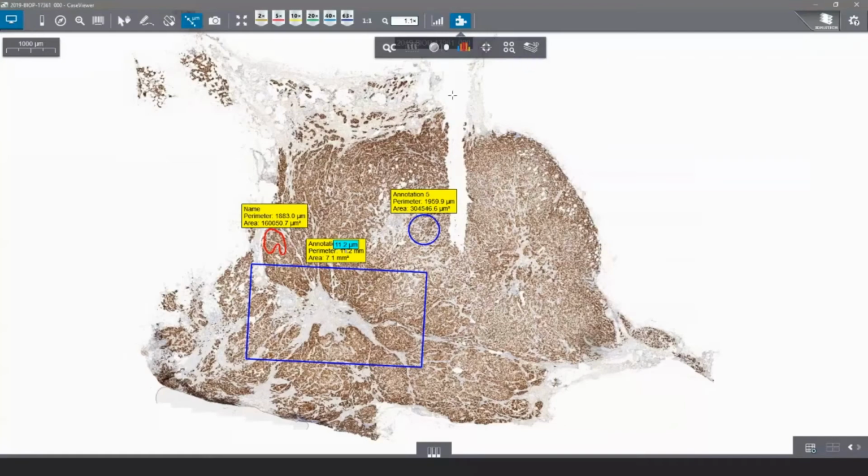On this slide, first, I would like to show you the digital differential interference contrast feature and the gradient map visualization. Later, I will show you all the other plugins as well, but for the rest of them, I will need a different digital slide.